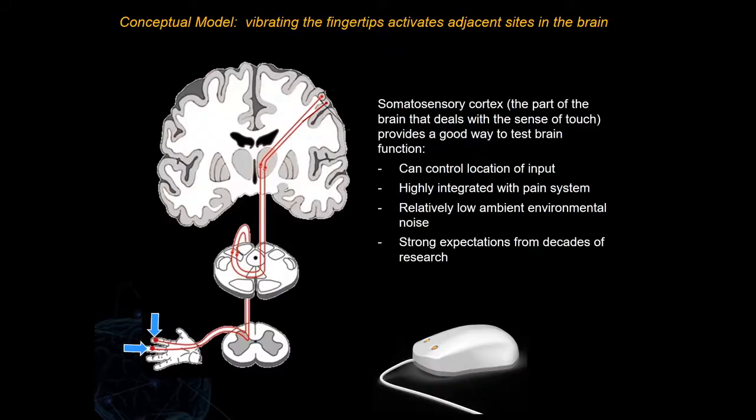And let's go to the next slide. When you see that two places on the skin, or two fingertips, are activated by the brain gauge, it activates two places in the brain that are side by side. And what that does is activate two places in the brain that talk to each other. Those two spots talk to each other in a very specific way, which has been studied for many years, and we have a very good idea about how those interactions are supposed to occur. And what we have done is we've developed specific tasks that relate to those specific functions in the brain.